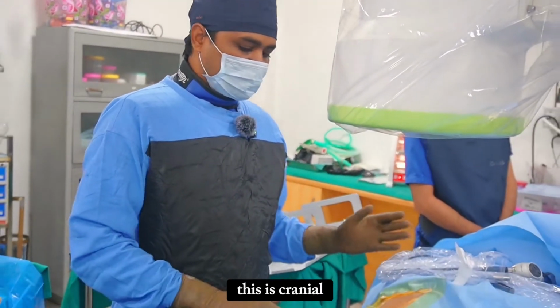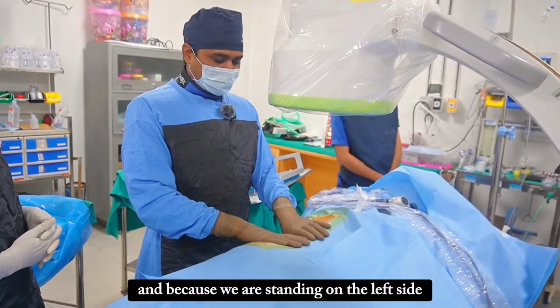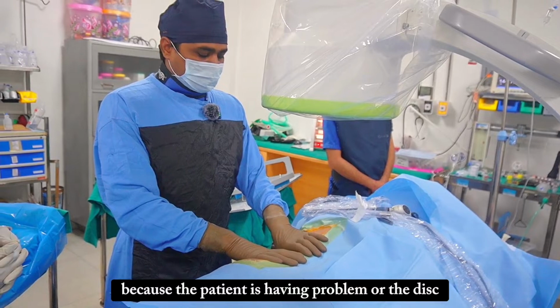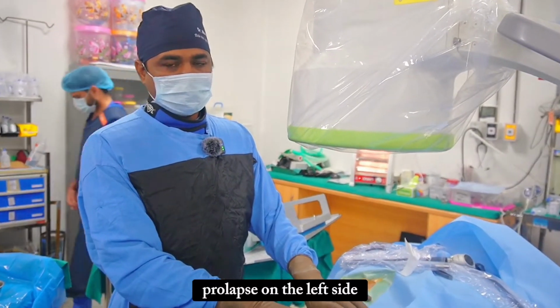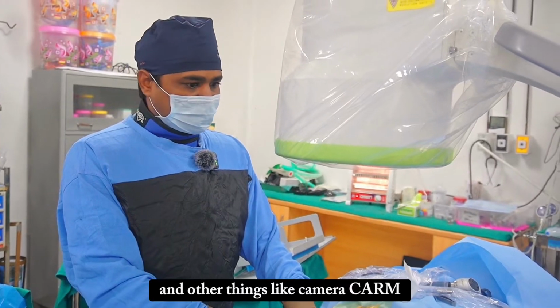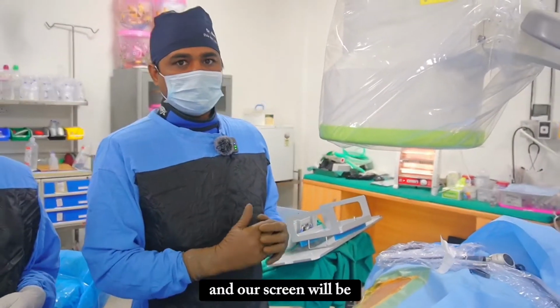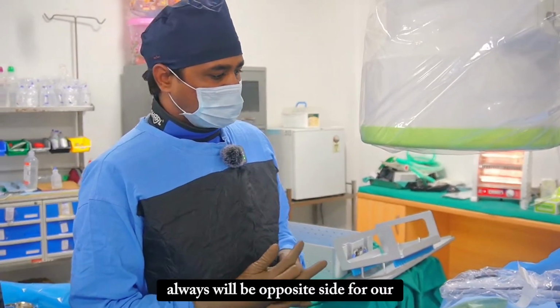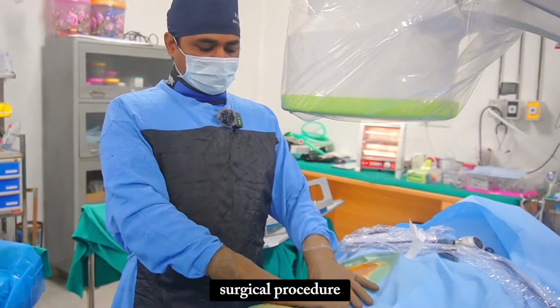This is cranial, this is caudal, and we are standing on the left side because the patient has the disc prolapse on the left side. Other things like the camera, the C-arm and our screen will always be on the opposite side for our convenience during the surgical procedure.